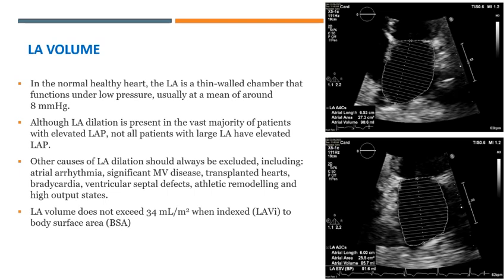Other causes of left atrial dilation should always be excluded, including atrial arrhythmia, significant mitral valve disease, transplanted hearts, bradycardia, ventricular septal defects, athletic remodeling, and high output states. Left atrial volume does not exceed 34 milliliters per square meter when indexed to body surface area.